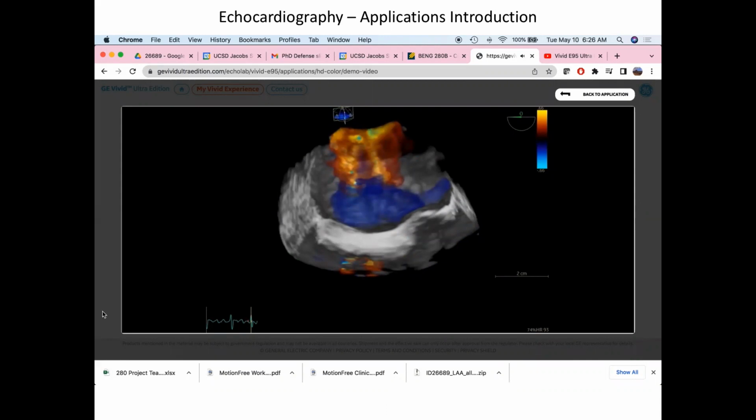So if you assume that the person's heart rate is 65 and it's locked, the R to R is exactly the same, the time between QRSs, then things should be okay, right? Because if the timing is identical, the volume of blood brought into the left ventricle on each beat and the amount ejected is stable. And you know, for a stable, normal person, every beat is pretty well the same.